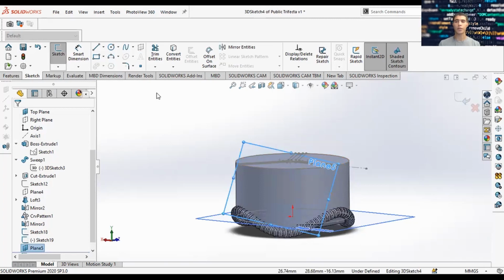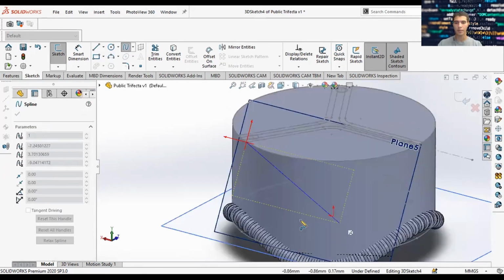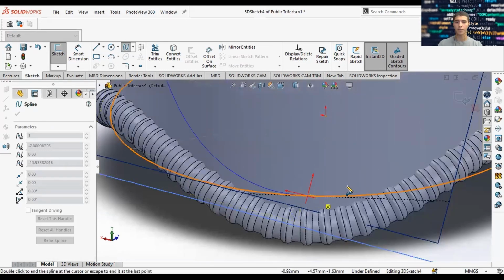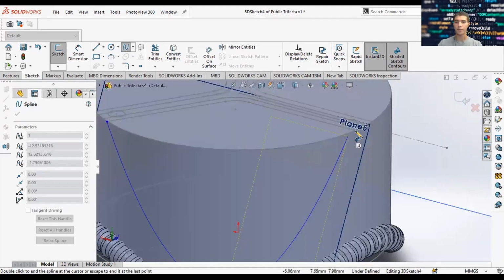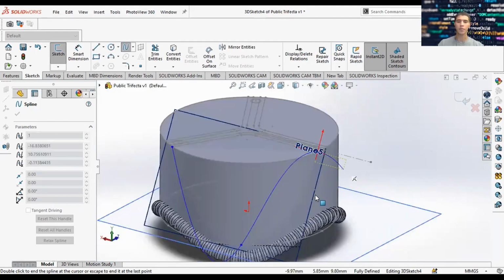And here is where I introduce you to the spline feature. So before we did an equation-driven curve, or a function-driven curve, now we're going to do a spline. And we're going to select the spline between this point, the point we selected down here, and this point. And once you're satisfied, you click escape.